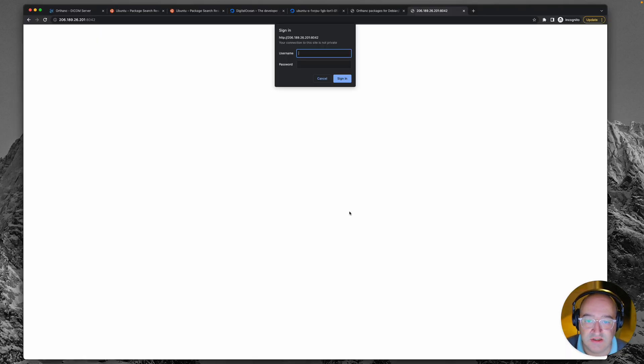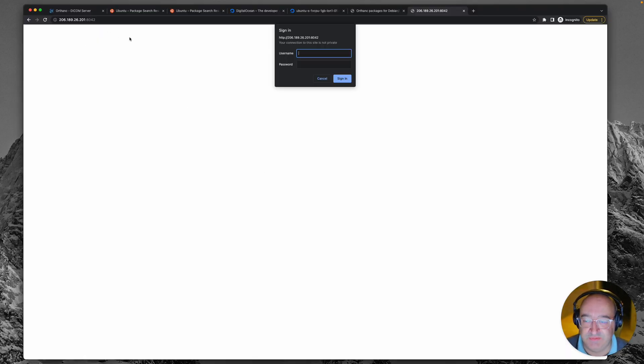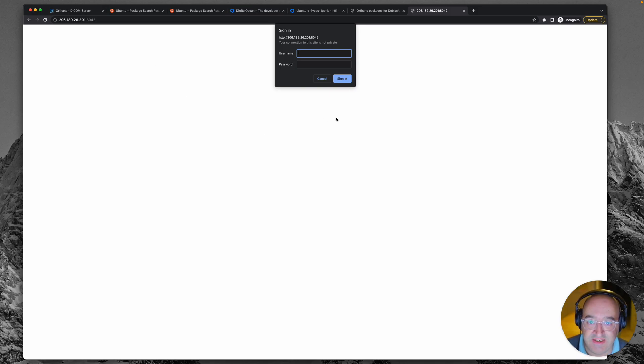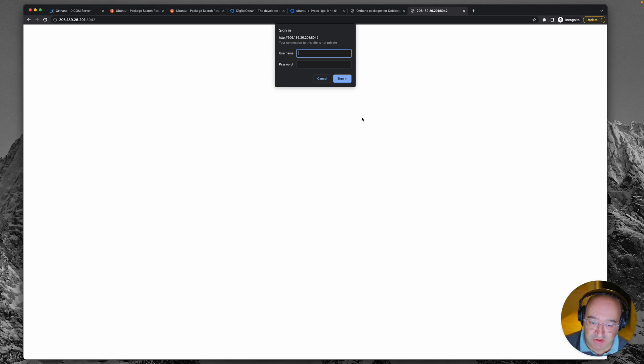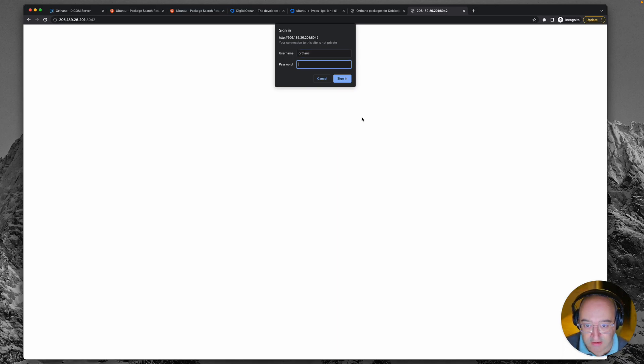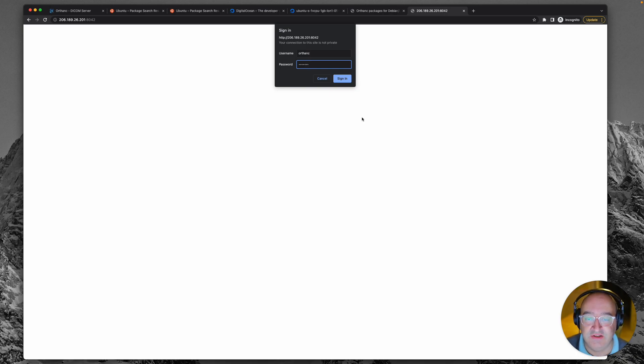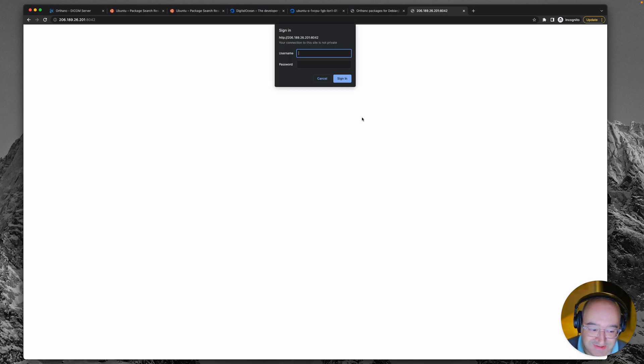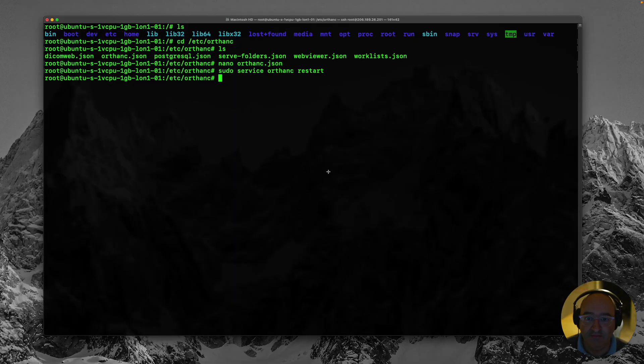So I'm back over in my web browser. I've come to the same page. My IP address port 8042. And I've got my username and password prompt. So let's try it. Orthanc. Orthanc. Fingers crossed. Huh. Didn't work.